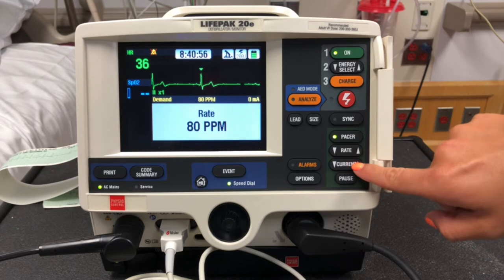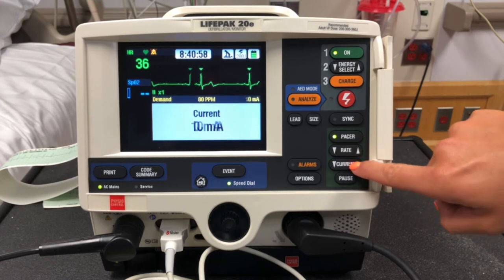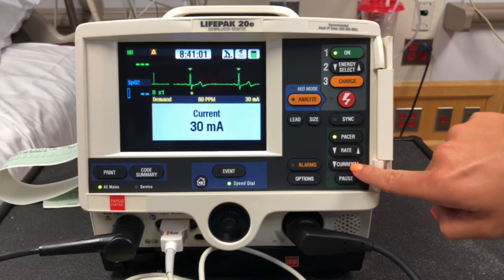We're going to choose the current until we see the pacer spike before the QRS.